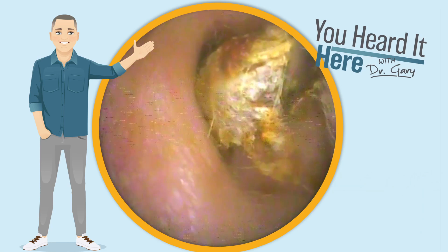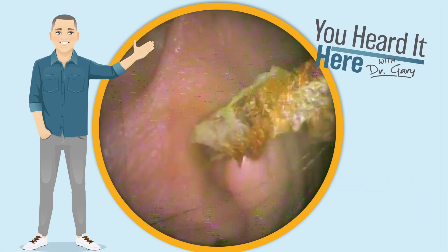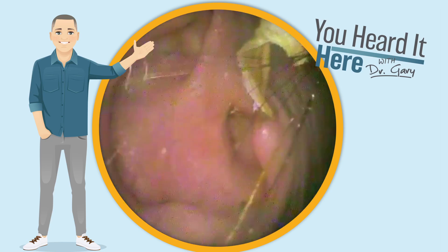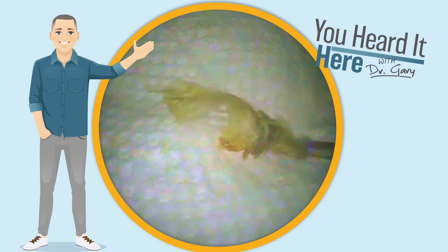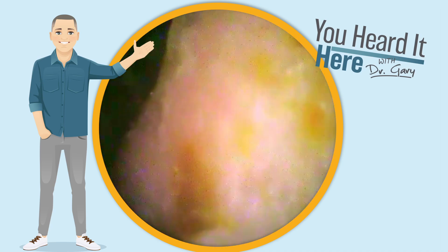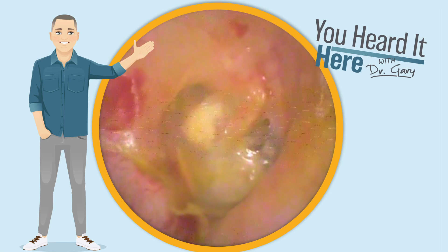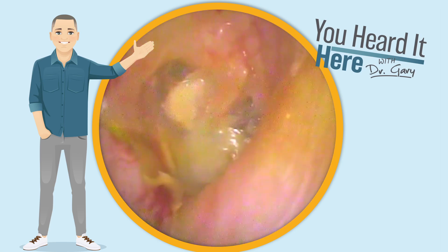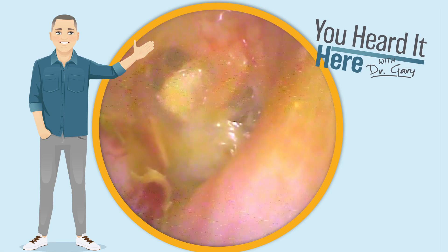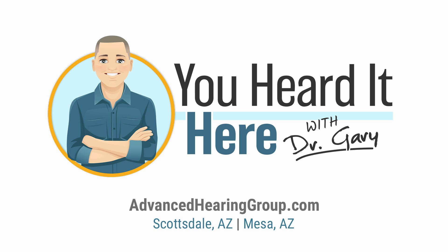As you can see, we're using those alligator forceps slowly trying to break that skin and wax free. And look at that nice long ribbon — that's about an inch long. That's quite a bit of wax and quite a bit of dead skin. As we look down, we can see the eardrum and we definitely see a little bit of irritation where the skin was attached. Given this patient's history and knowing that they're going to be going back to see their primary care doctor and ENT in the future, we're going to leave the rest of that back there for the ENT to get a really good view.